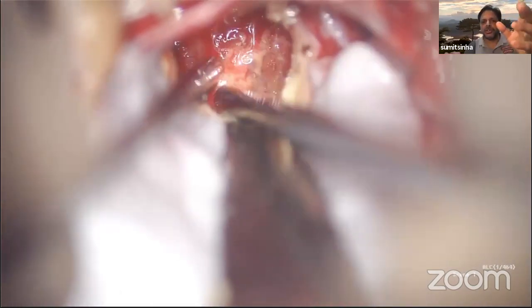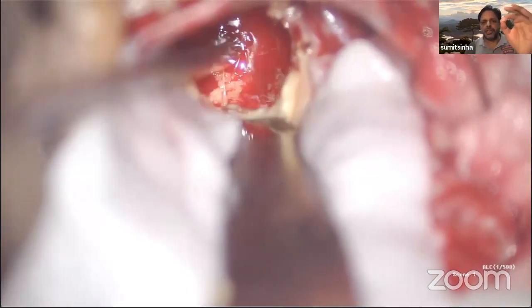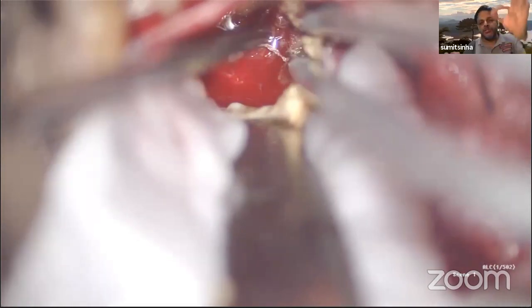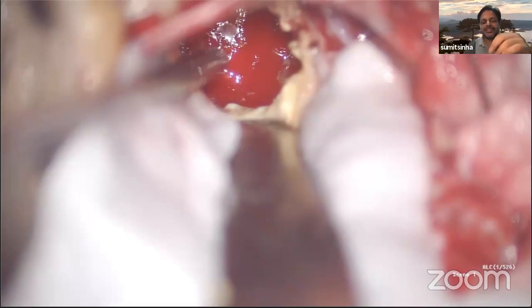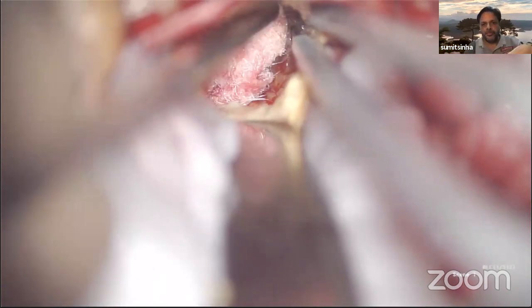So you have to judge accordingly during the surgical procedure what percentage of the tumor capsule has become manageable by your internal decoring. Only that part of the tumor capsule are you allowed to lift with the tumor holding forceps and then dissect from the surrounding adjacent structures. Now, these structures can be lower cranial nerves, brainstem, or cerebellum. It all depends on where you are decoring this tumor from.